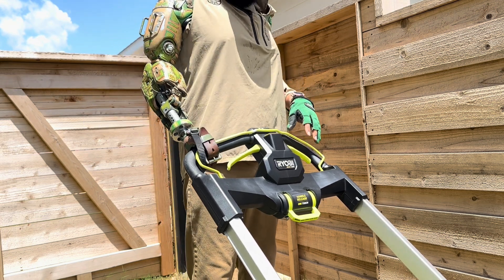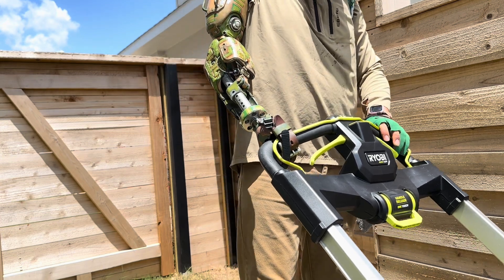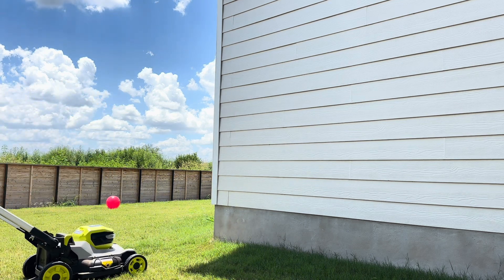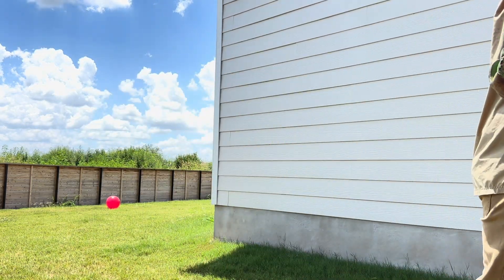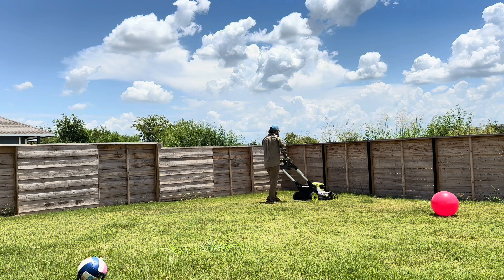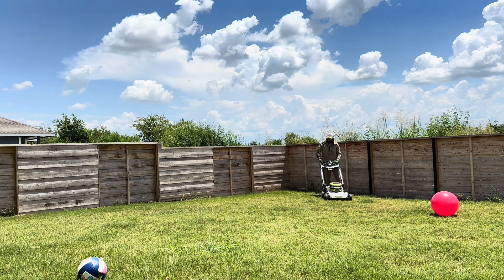I wanted to show tasks like this rather than just weightlifting and shooting guns, because bionic arms powered by batteries and motors don't do really well yet in 2024. A lot of them are still made out of plastic, versus legs which are almost all metal. Just mowing the lawn — you wouldn't think that's a big deal — but with bionic prosthetics operated by wires and motors, the weak points are plastic. At 97-degree heat, just the vibration from the lawn mower will break the wrist.